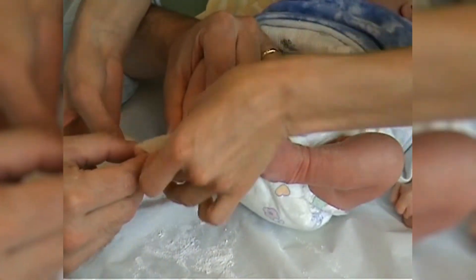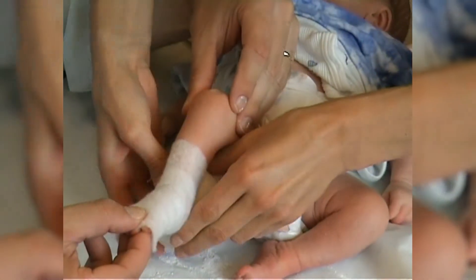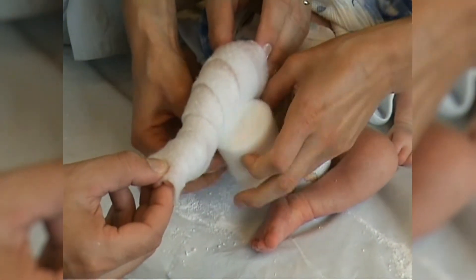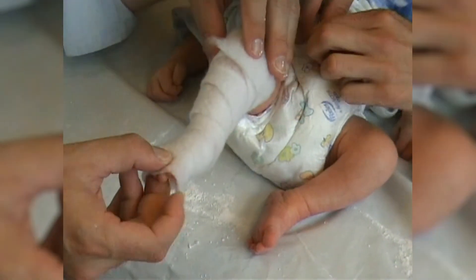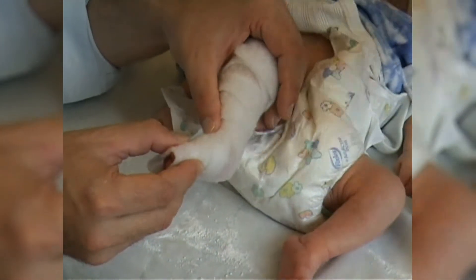The cotton padding is applied very closely to the foot and more loosely in the calf region. For demonstration purposes we will see the application of the short leg cast first, which will then be extended to a long leg cast. A slight abduction of the foot can already be seen.